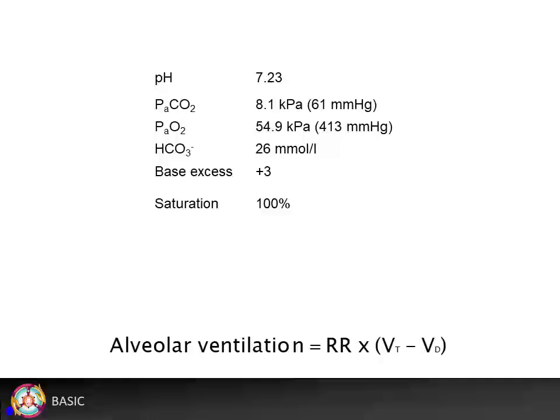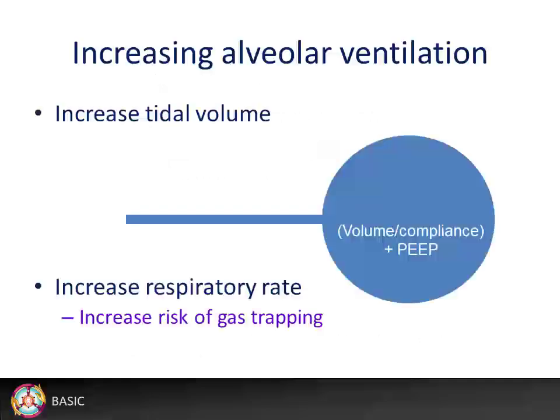This can be achieved by increasing the tidal volume or increasing the respiratory rate, or both. Increasing tidal volume increases alveolar pressure and risk of barotrauma, while increasing the rate increases the risk of gas trapping. So what should we do?